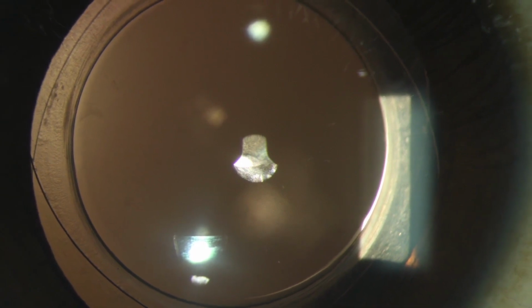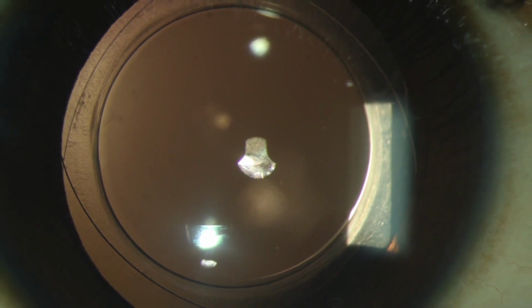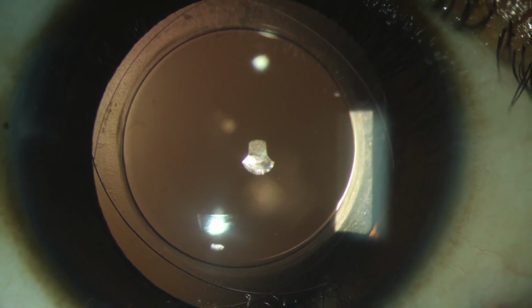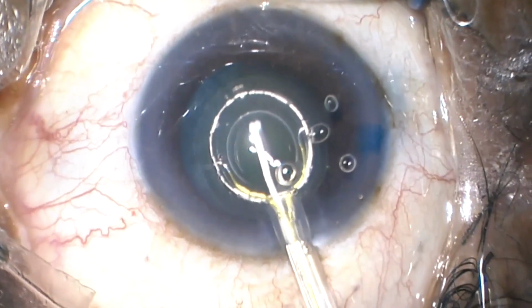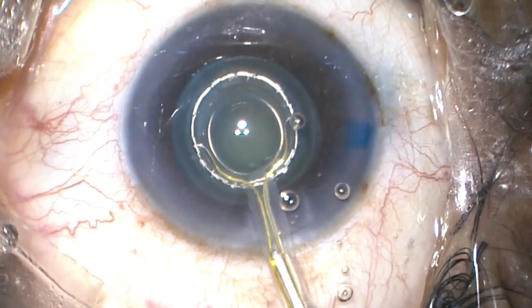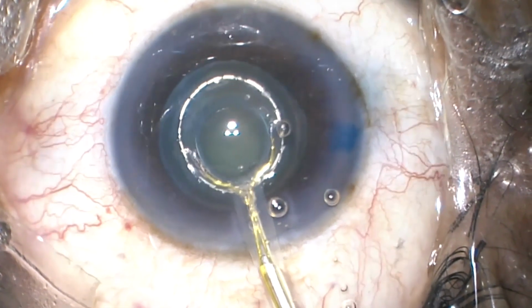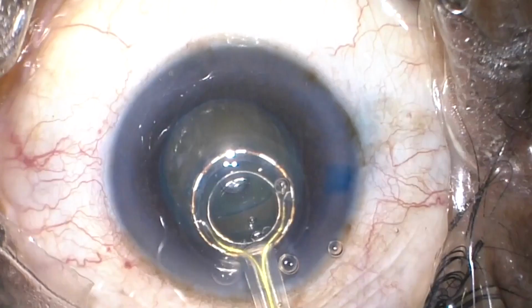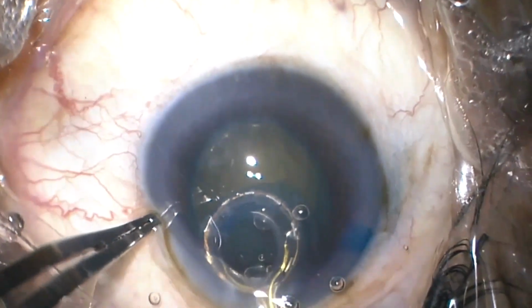Precision pulse capsulotomy, which consistently produces a circular, accurate, strong and well-centered capsulotomy, is a new innovative technology developed by Zeptomed. The probe is collapsed and inserted into the anterior chamber, which is then reopened, centered, and suction is applied. A series of nanoelectrical pulse waveforms are applied through the nitinol ring, resulting in vaporization of water molecules trapped between the ring and the lens capsule, thereby causing an instantaneous 360-degree mechanical cleavage of the stretched capsule.